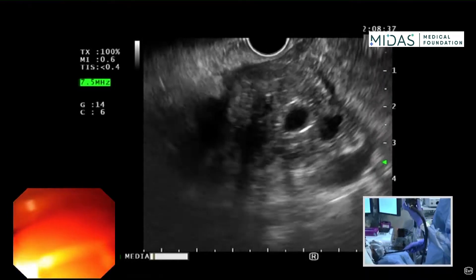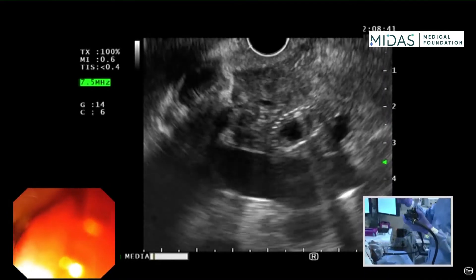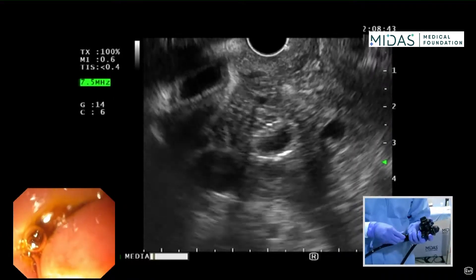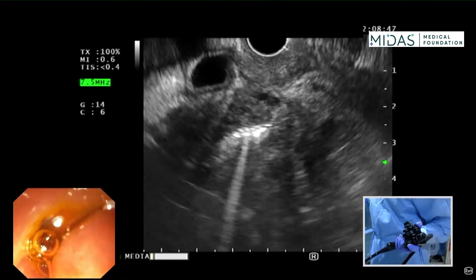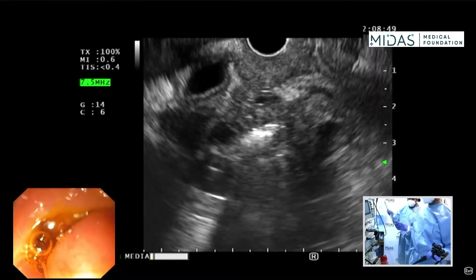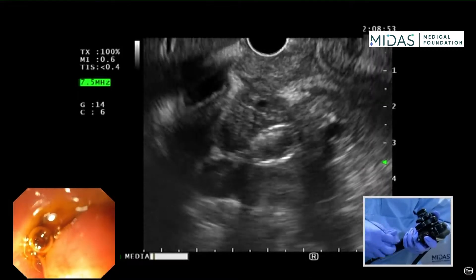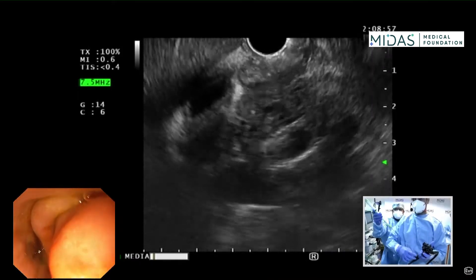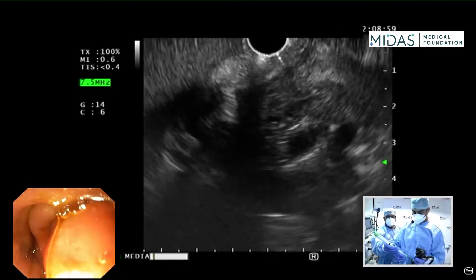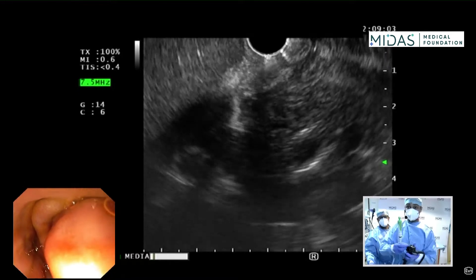Let's go ahead and start with the FNB. I'm going to remove the cap on the endoscope. Using this needle, we advance it across. We have our technician Shailesh who is going to help me with this case. Always make sure that your dials are unlocked.